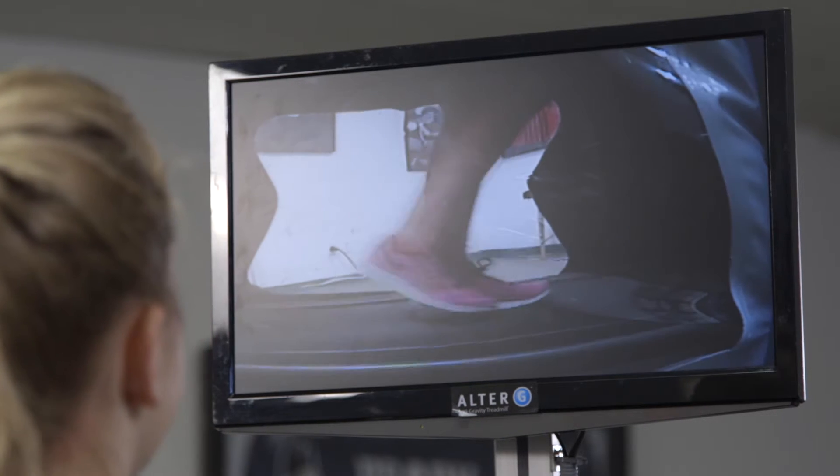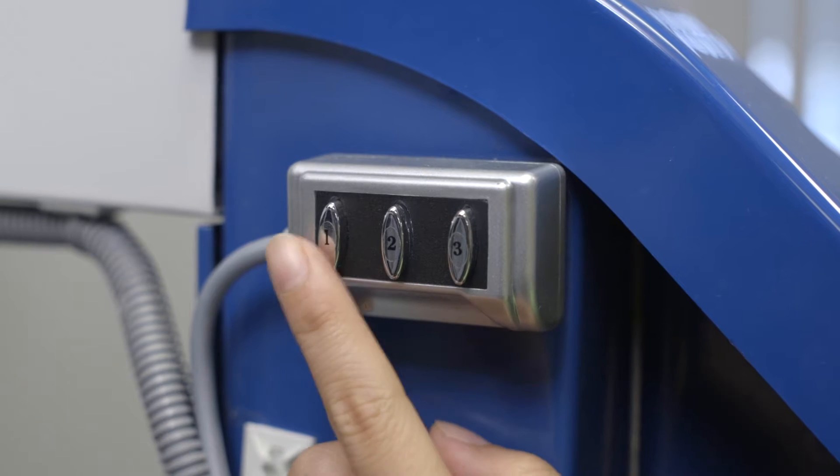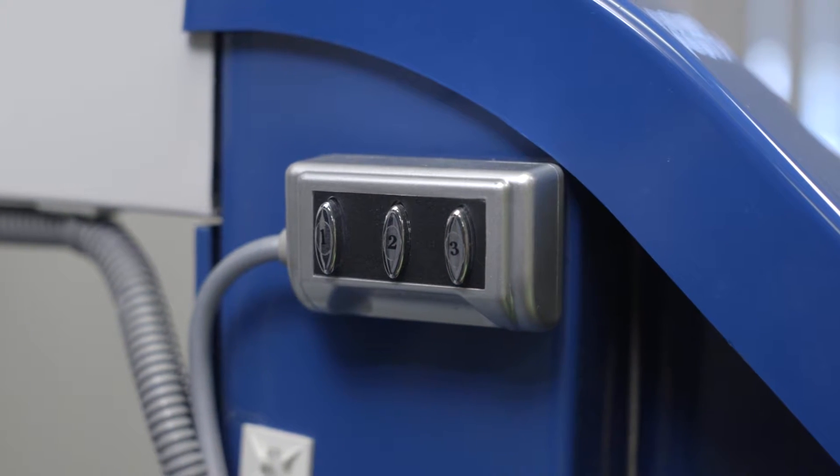The video monitoring system provides three different views when in use: a front, lateral, and rear view. To alternate between camera views, use the switch pad located on the front pillar of the AlterG.